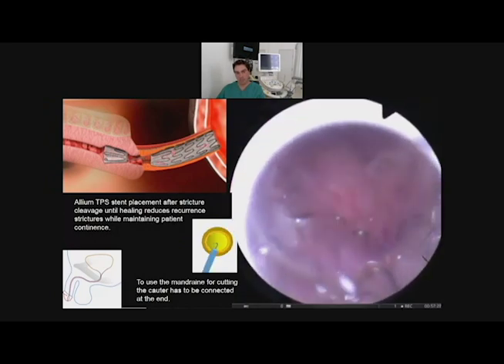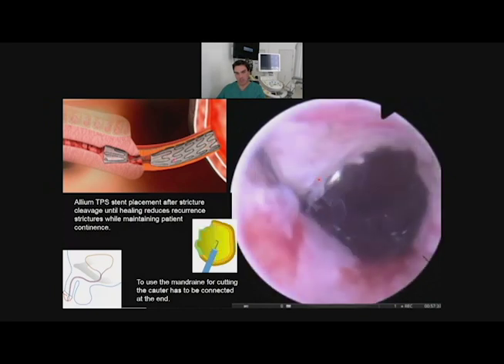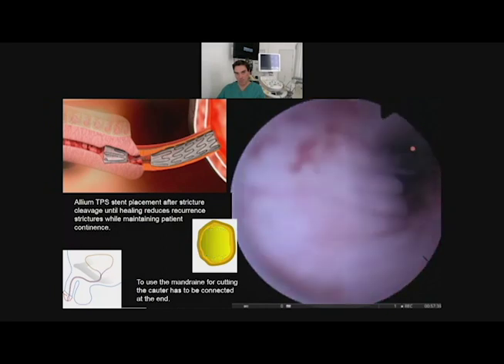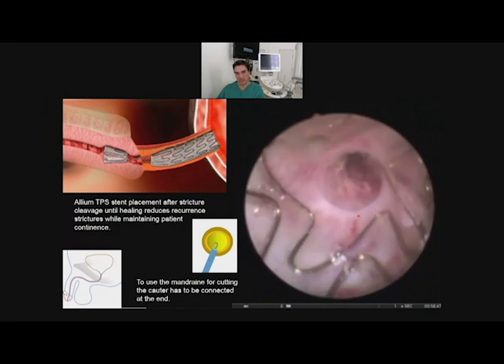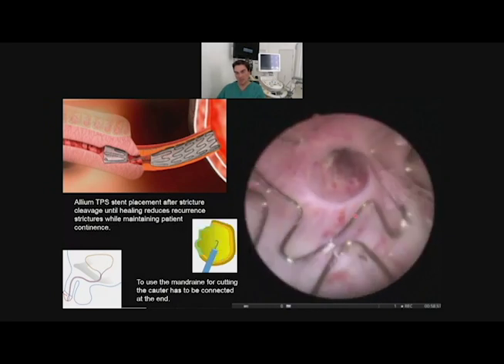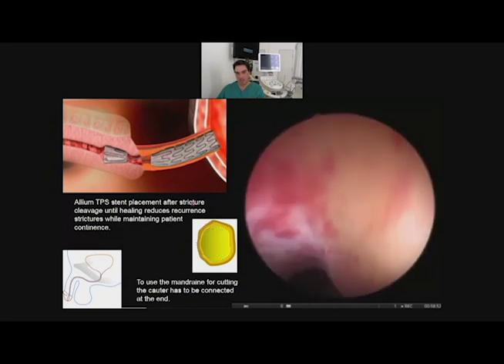The tip is 2-3 centimeters on top. You see it here, that is near side by side. That was an area where we cut it. This is the anchor in the bulbar urethra. It's fixed, and so it is open. The patient can pass the urine normally, and he is also dry because it's only the stainless steel in the area of the sphincter, and all that's okay.